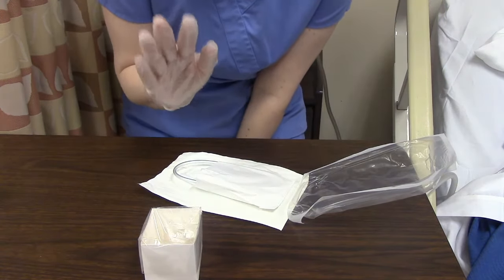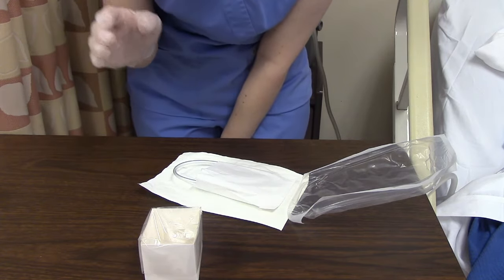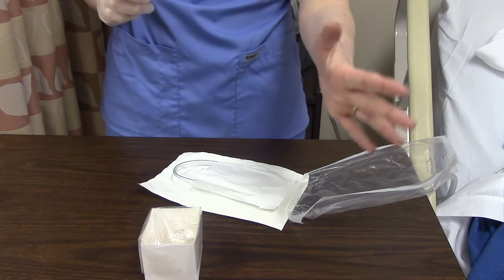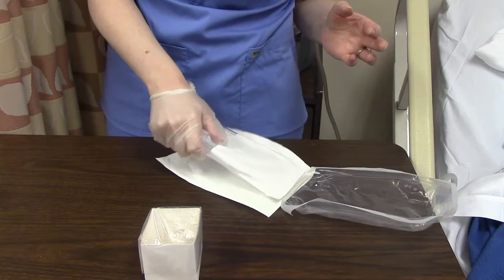This kit only comes with one glove — sometimes it's one glove, sometimes it's two gloves. But you can remember that the hand with the glove needs to be sterile. Our non-sterile hand, our non-gloved hand in this instance, is going to touch everything else.